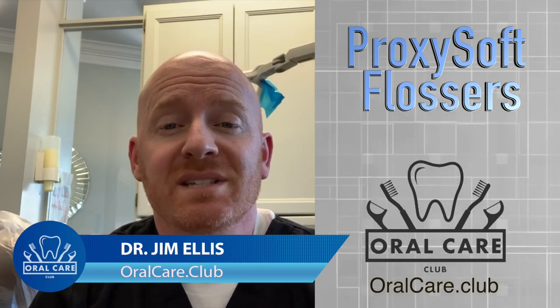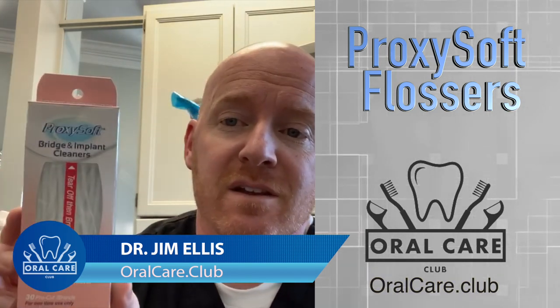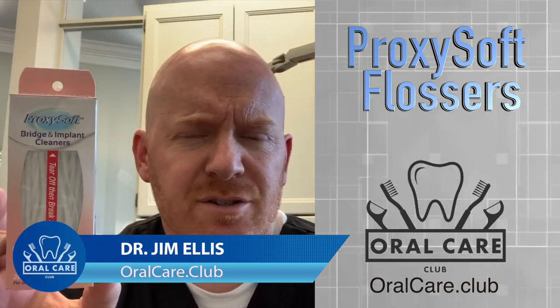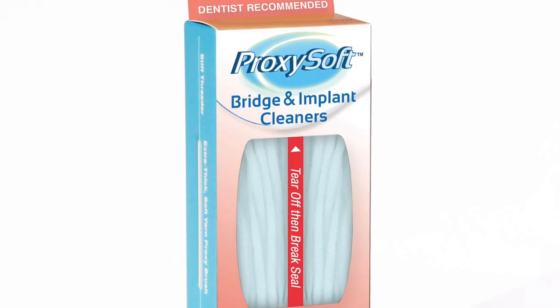Dr. Ellis for Oral Care Club. Today we're going to be reviewing Proxisoft flossers. Now these flossers are different — they're really special and actually unique, and I love these for my patients.